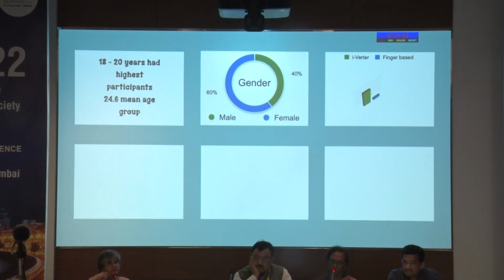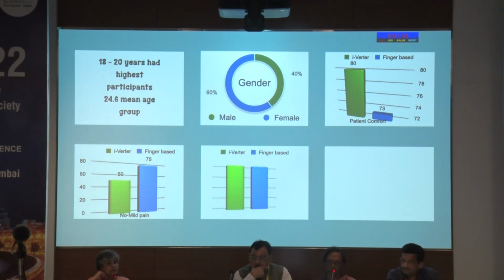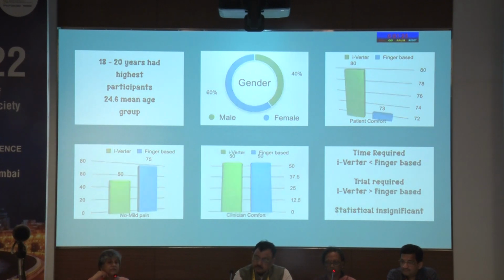The mean age group was 24.6 years, and 40% were male and 60% were female. Patient comfort wise, iVerter was better. The finger-based technique experienced no to mild pain. iVerter and finger-based were equally preferred by the clinician with regards to comfort. Time required was more for finger-based. Trials required were more for iVerter.